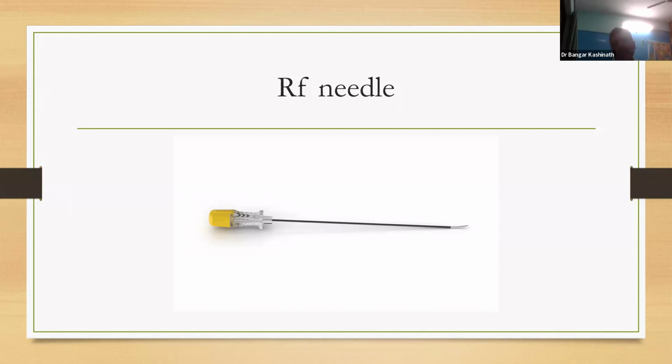Here, in the viva, if you talk about this, you should know what tip to be used in which particular block commonly. So it's not a standard, but commonly a few uninsulated tips are used in a few different blocks. So that you should be aware of.